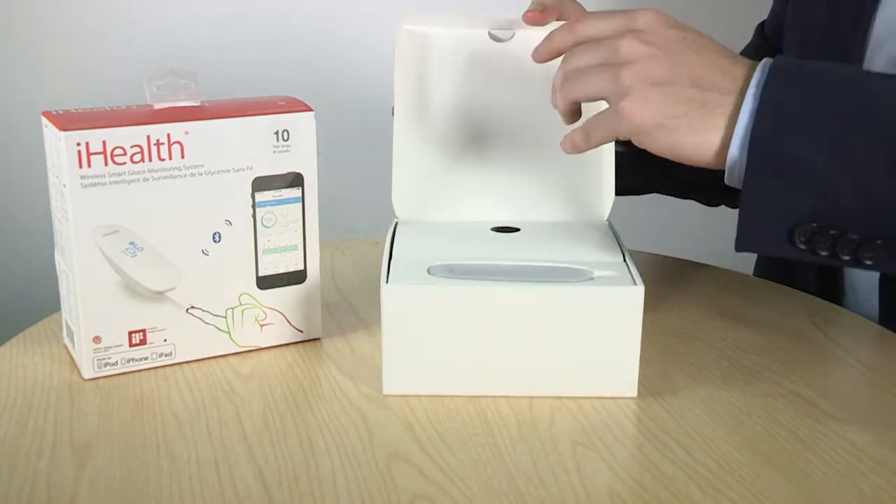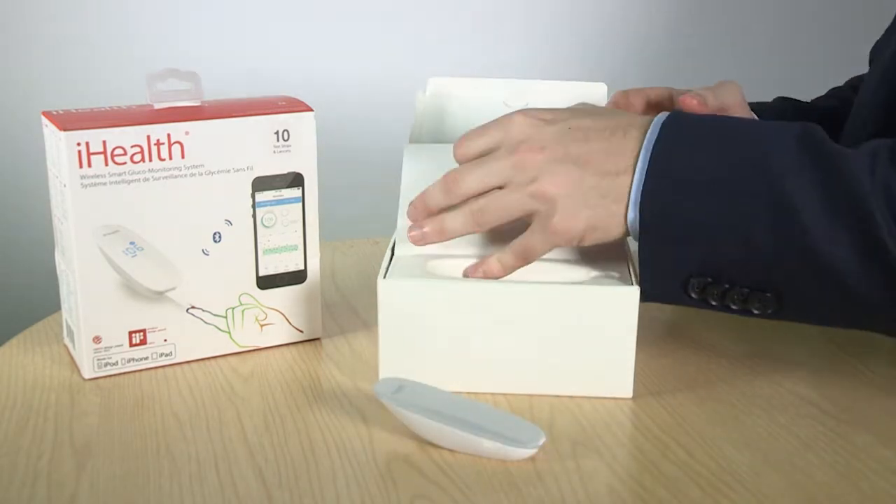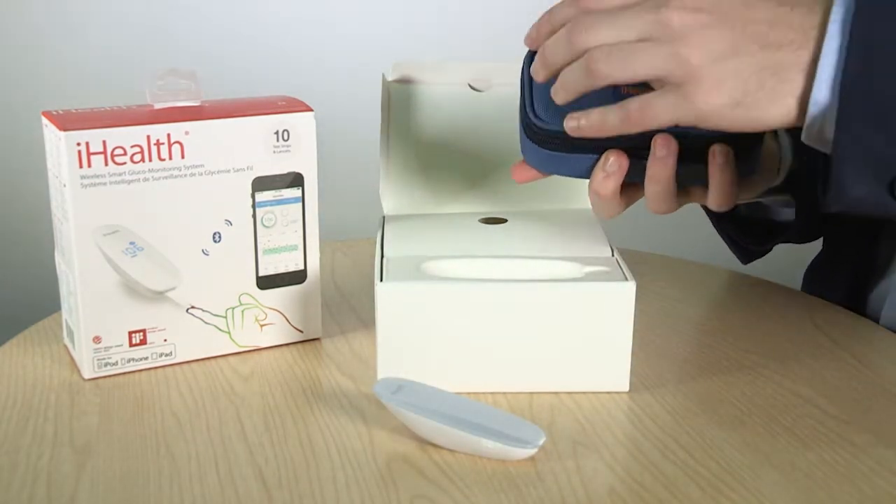If you're a diabetic, managing your blood glucose levels easily and effectively can be tricky, especially if you're trying to keep track of your results throughout the week when you're busy. This is a great product for those who wish to manage their diabetes using their iPhone or Android smartphone.